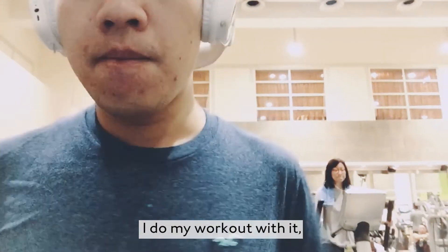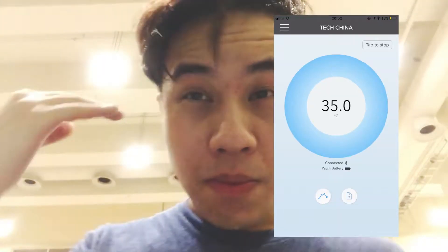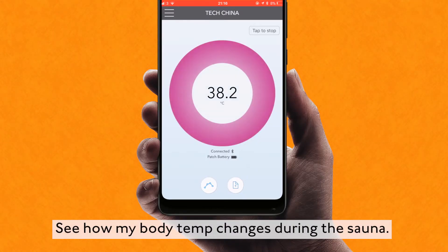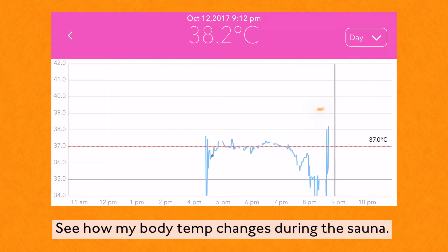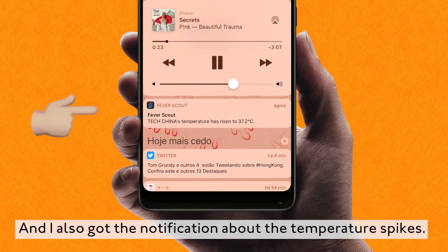For the rest of the day I do my workout with it, and take a sauna with it to see how my body temperature changes during the sauna. I also got a notification about the temperature spikes.